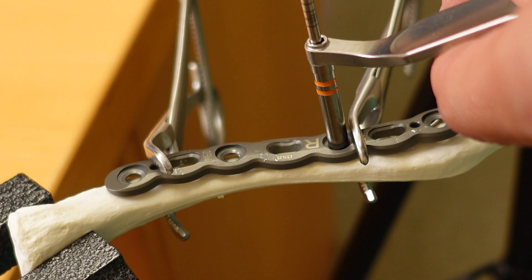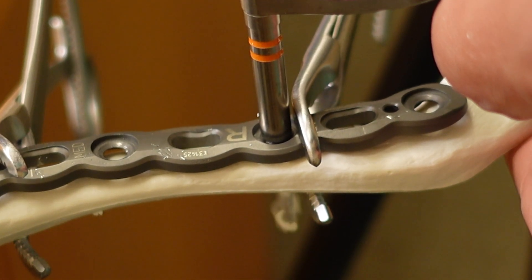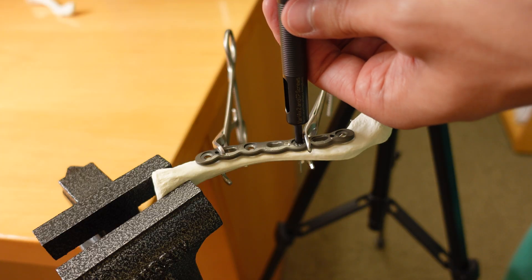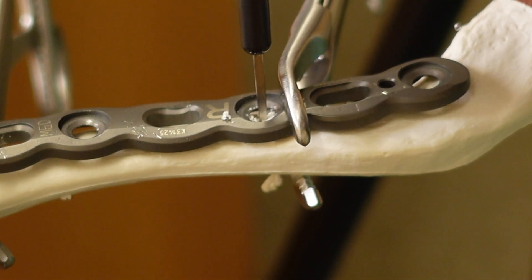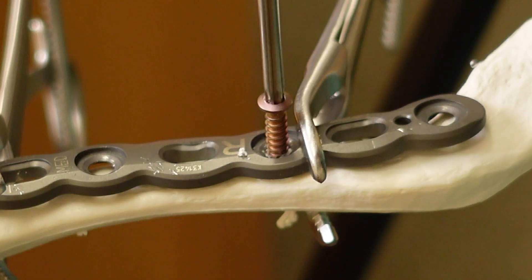We are then ready to start drilling to secure the plate in place. We use the drill guides to help position the screws appropriately and center them in the plate hole as closely as possible. Once the hole is drilled, we measure for the screw length, making sure it's long enough to engage both sides of the bone.